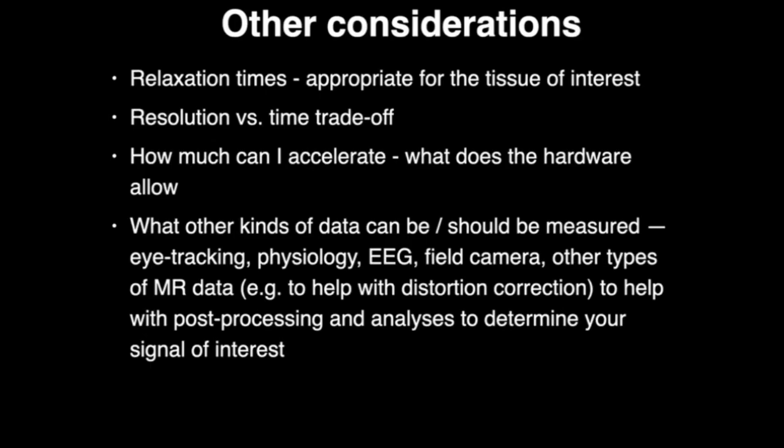Again, you want to look at how your relaxation times, your T1s and T2s, vary with the fields that you are targeting. Again, with covering k-space, you need to get things at high enough resolution to answer your questions. This is the eternal trade-off. With us hopefully getting our hands on local gradients soon, we'll have more leverage to not give up as much, but fundamentally that will not completely disappear.